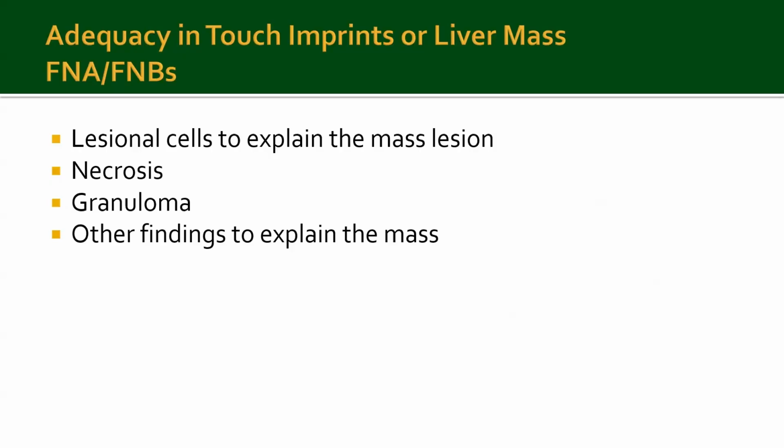And lesional cells are usually considered malignancy or indicative of a benign tumor that can be explained and associated with the size and location.